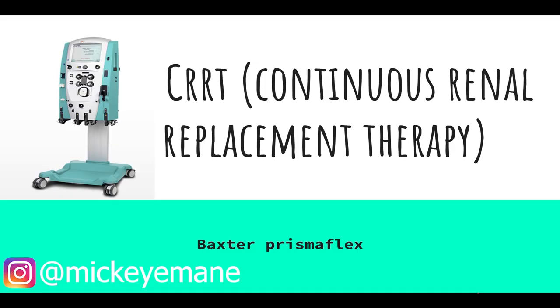Now, by all means, I'm not going to talk about everything you need to know about CRRT in this video, but I will talk about the basics of what you need to know in working with a CRRT machine.